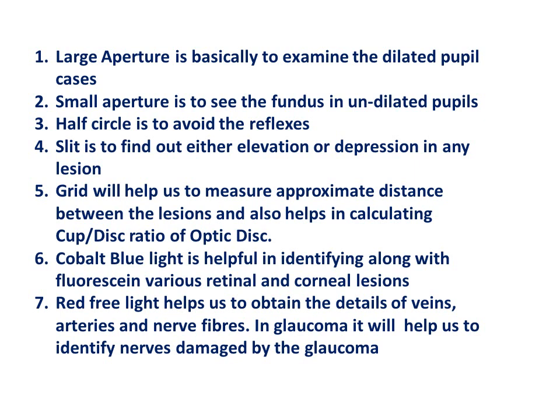So here you can visualize that even though it is an exclusively posterior segment examination equipment, sometimes corneal lesions can also be examined by the cobalt blue light of the direct ophthalmoscope. So in some cases it also helps us in assessing the anterior segment.